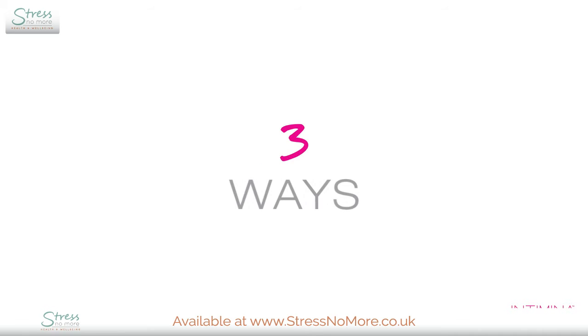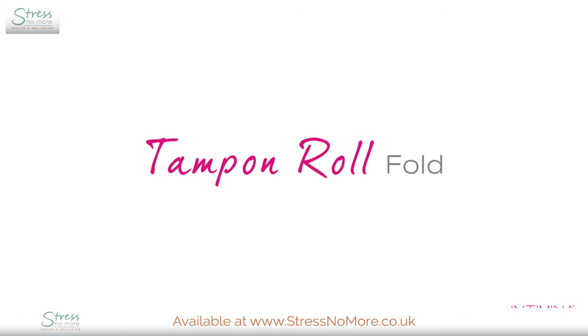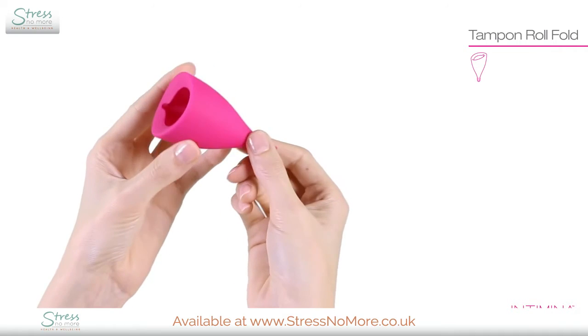There are three ways to fold the cups. Try the different techniques and pick the one that works best for you. The LilyCup is the only cup that can be rolled as thin as a tampon.